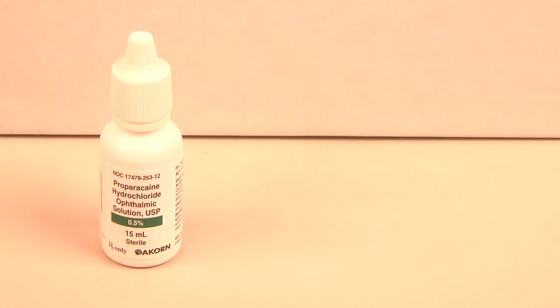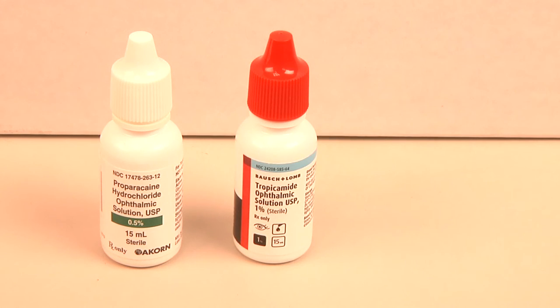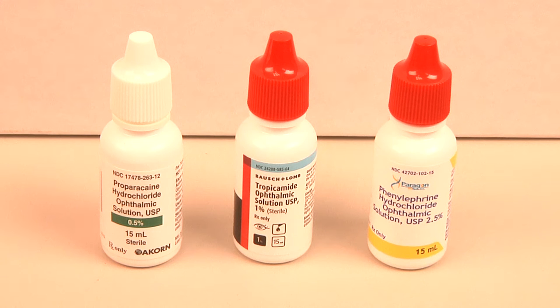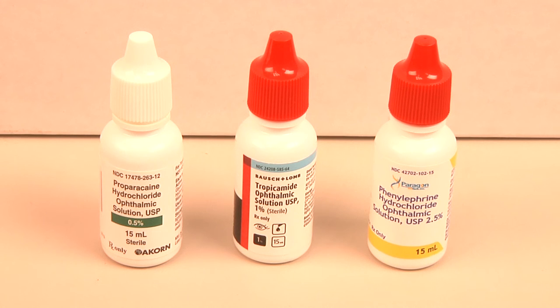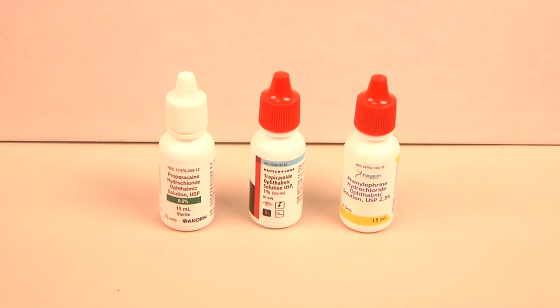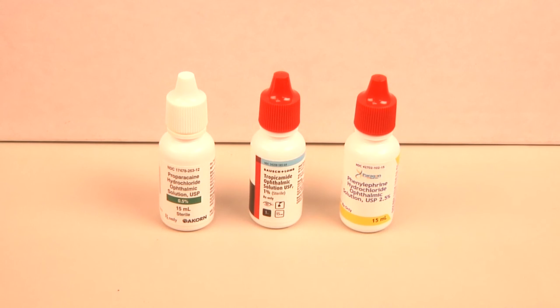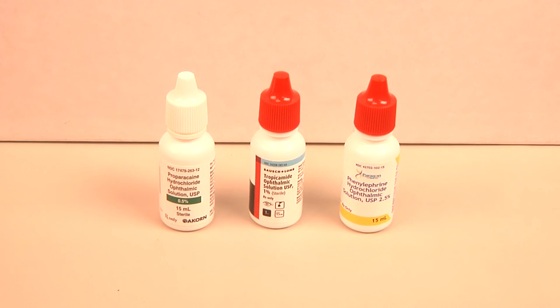Topical ophthalmic drops are also necessary. The patient must be fully dilated to view the peripheral fundus. A topical anesthetic such as 0.5% proparacaine is recommended for comfort, followed by 1% tropicamide and 2.5% phenylephrine to achieve temporary dilation. The drops will be at maximum effectivity about 30 minutes after instillation. More topical anesthetic may be needed if the on-the-globe technique is performed; no extra anesthesia is usually required for indentation over the eyelid.